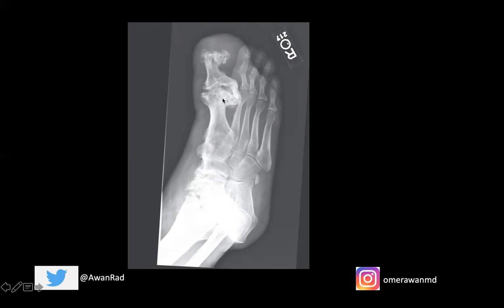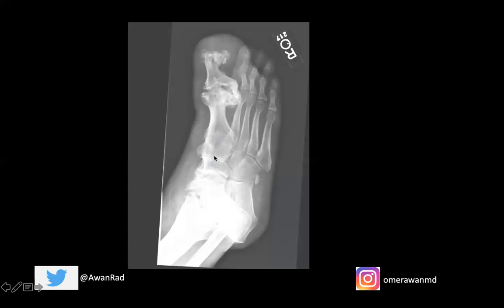This can cause bowing deformities, and it usually presents as abnormal growth of certain digits. The one key complication that can be devastating is early osteoarthritis. This 23-year-old already has moderate to severe osteoarthritis at the first MTP joint — look at the degree of osteophytosis, subchondral sclerosis, cystic change, and degenerative changes along the entire midfoot at the TMT joint, navicular cuneiform joint, and talonavicular joint. No 23-year-old should have this degree of osteoarthritis unless they have some underlying abnormality.